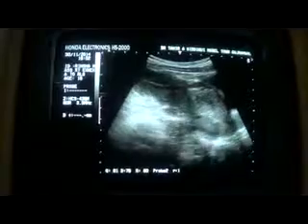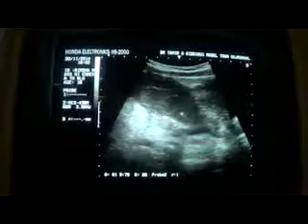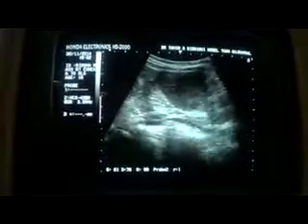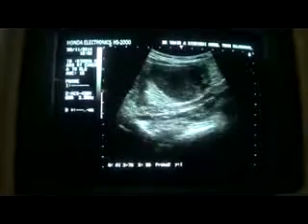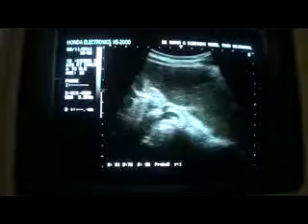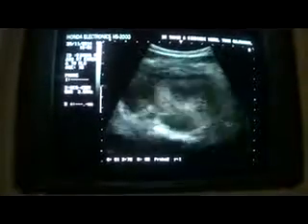But this mass, now it extends from the posterior surface of the uterus, and then it's seen extending up to the lower abdominal quadrant with iliac vessels seen running posterior to it. These are the iliac vessels that you are seeing. These are the iliac vessels that are running posterior to this mass. And let's study this, the transverse section of the mass.